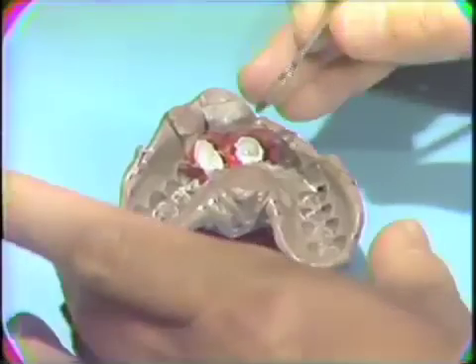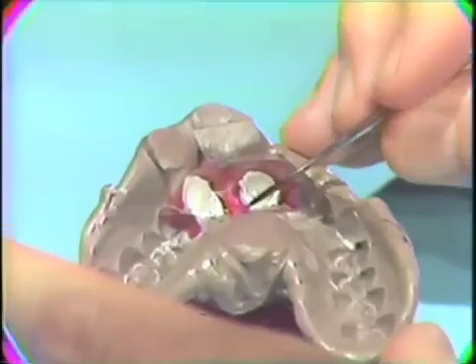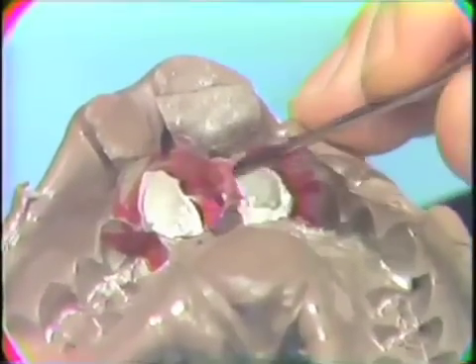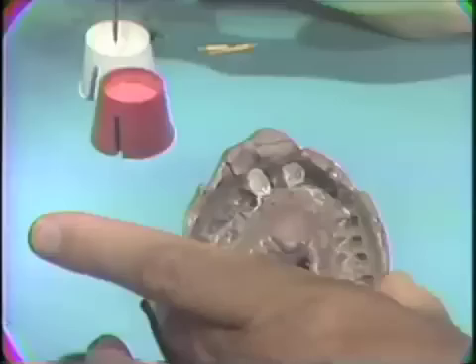After the rubber base impression has been plated, it is washed and dried. The utility wax is very carefully removed. It is important to remove the utility wax so that we can get an accurate registration of the ridge area and adjacent teeth.